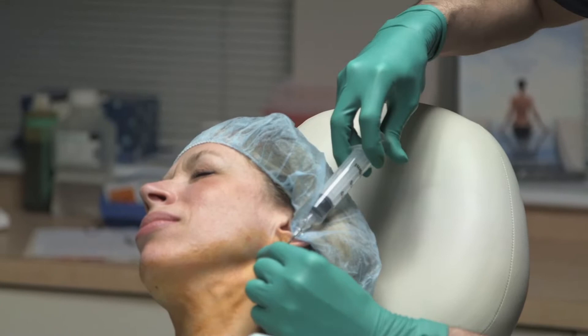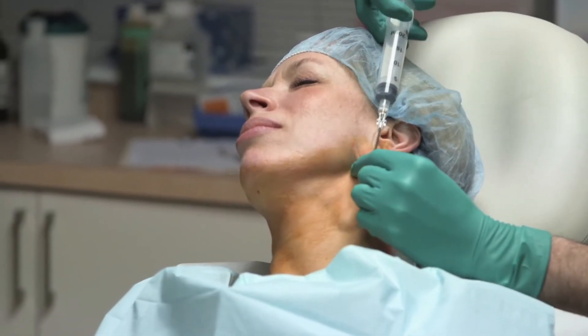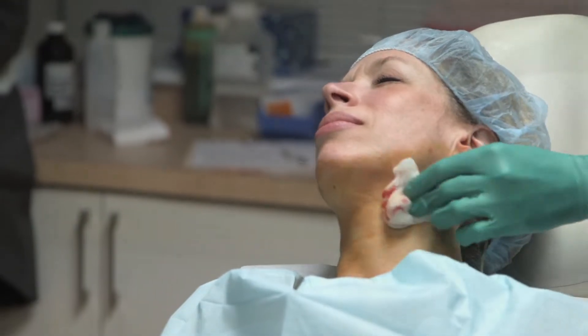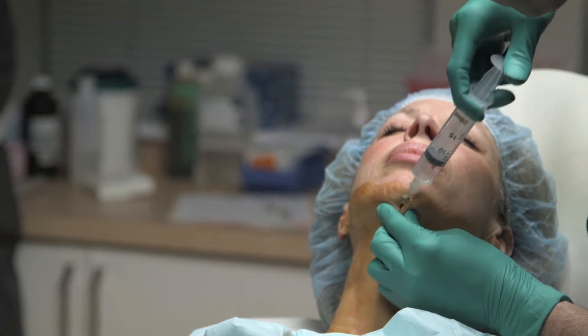Next, a tumescent anesthesia solution of your choosing is instilled through the lateral ports in the neck to get the lateral neck as well as jowls, and the central or medial port or pilot hole sub-mentally.